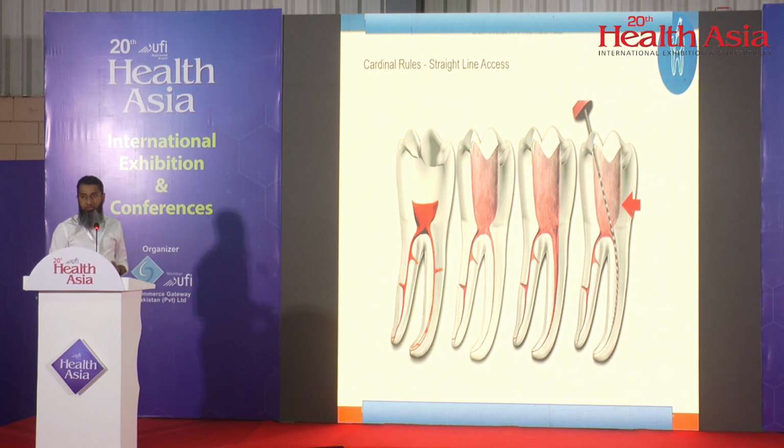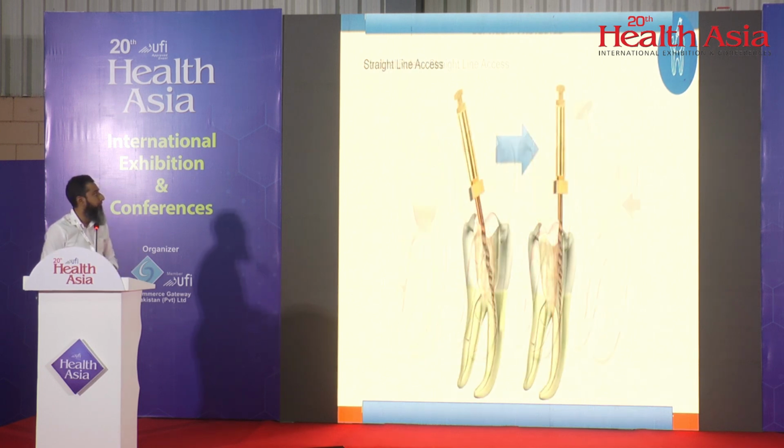That is why straight line access is emphasized. It will help you negotiate the canal better. Like here you can see before straight line access and after straight line access. Now you can see once the coronal constriction is removed, the coronal part is flared. Now your files can go more easily into the deeper parts of the canal.